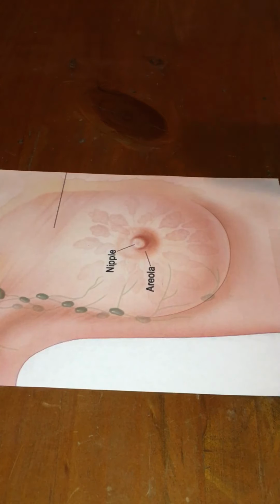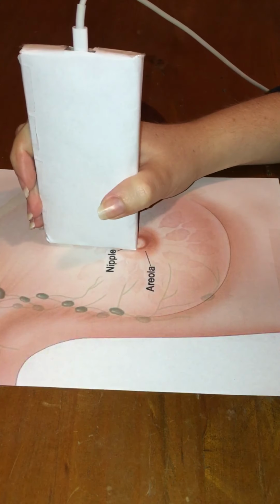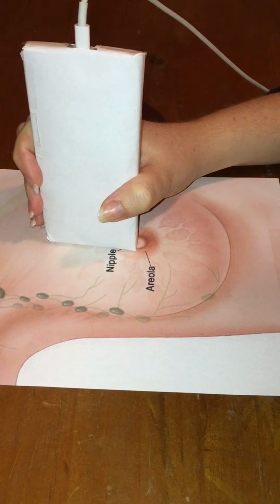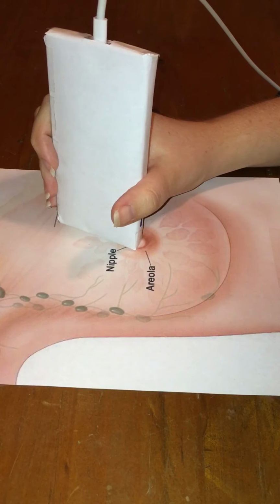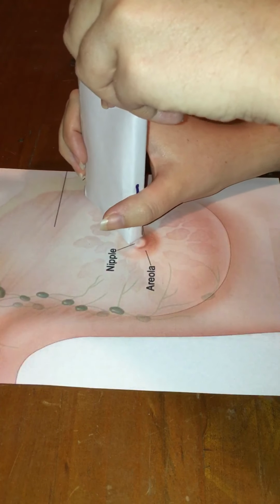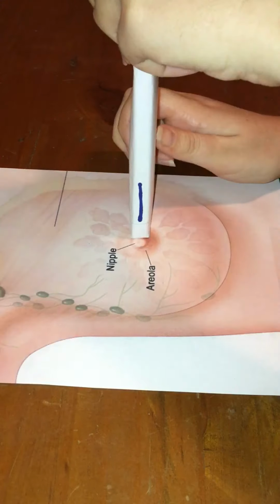This technique is carried out by having the marker of the transducer pointing towards the nipple at 12 o'clock and the transducer being on the inner breast. I then move the transducer radially, but always have the marker pointing towards the nipple.